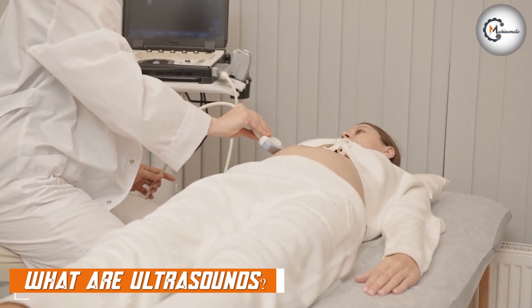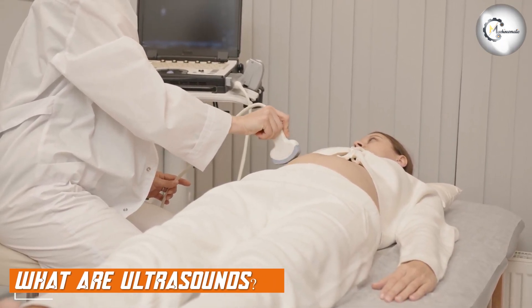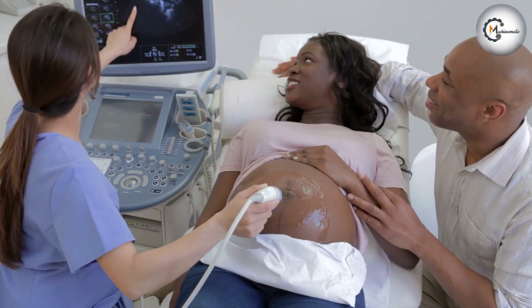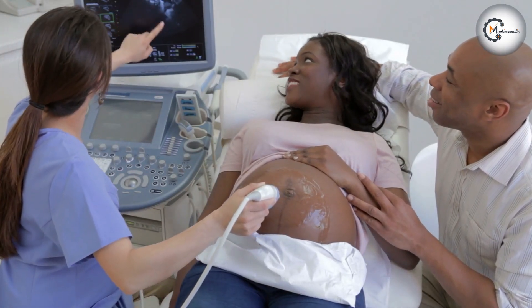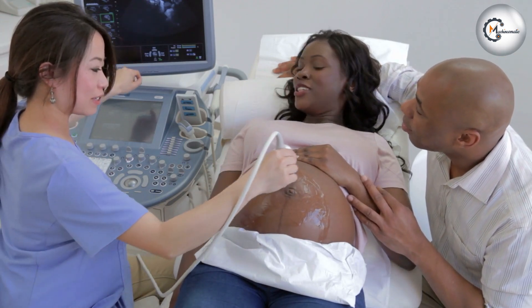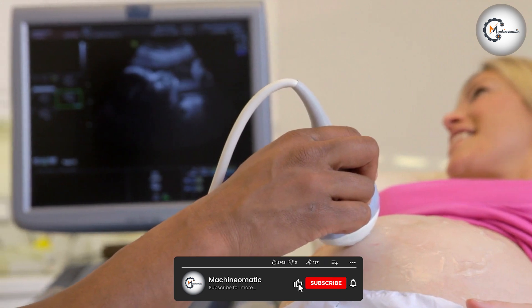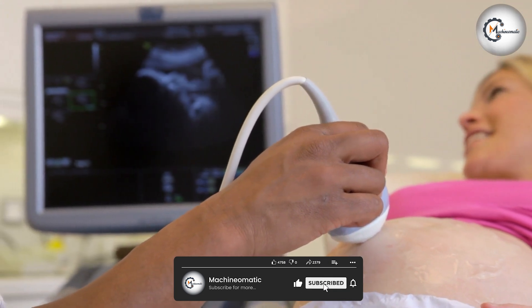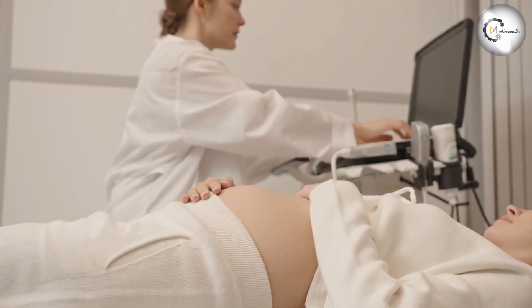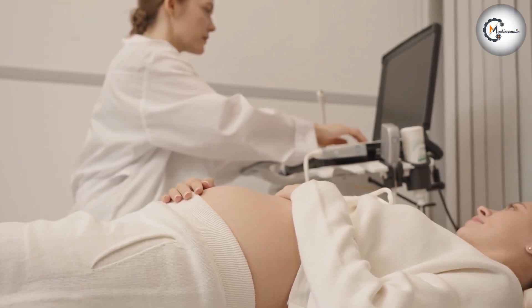Ultrasounds are a type of medical imaging test that uses high-frequency sound waves to create images of the body. During an ultrasound, a small handheld device called a transducer is placed on the skin over the area being examined. The transducer emits sound waves that bounce off the body's tissues and organs and are detected by the same device. The device then creates images based on the sound waves, which can be viewed on a computer screen.